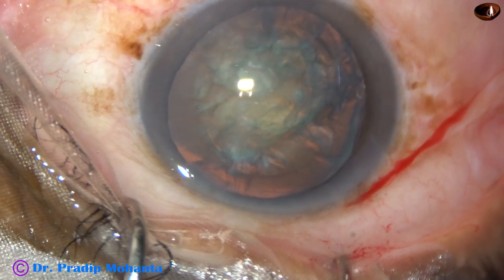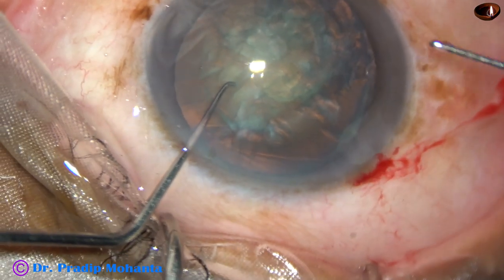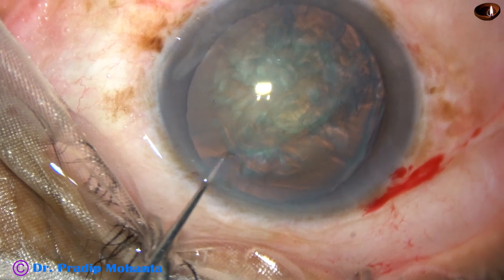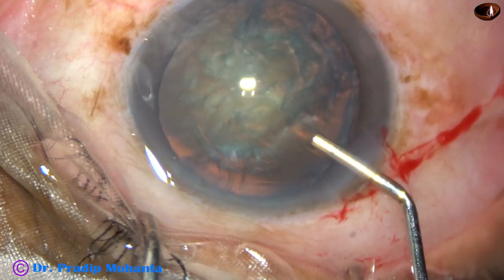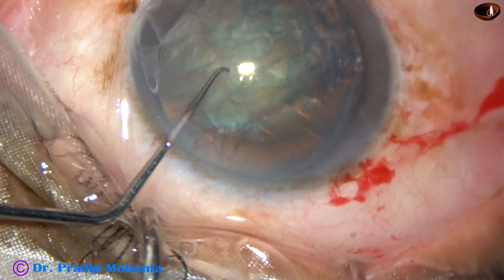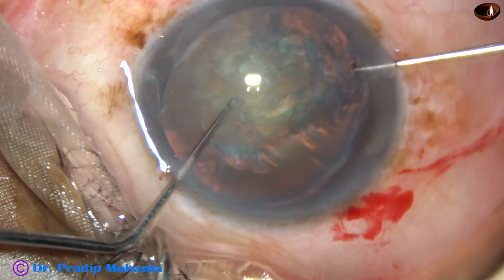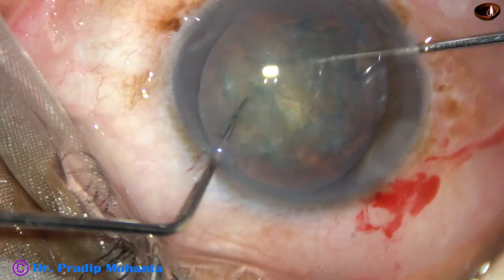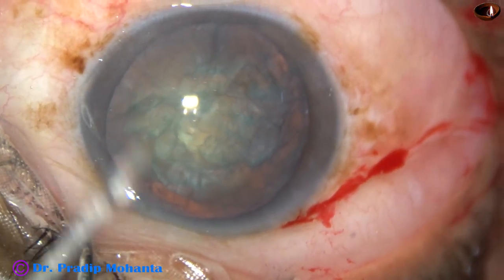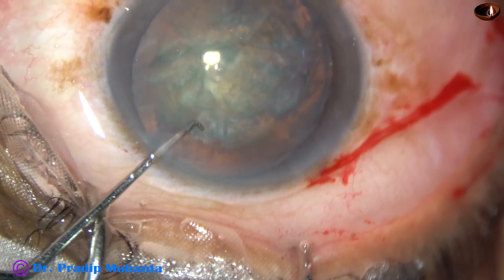Now I want to rotate the nucleus bimanually. But before that, I want to inject some viscoelastic — this is 2% HPMC. Two instruments are introduced through the side ports, and the nucleus is rotated clockwise bimanually. Now the tip of the phaco needle is introduced into the anterior chamber.